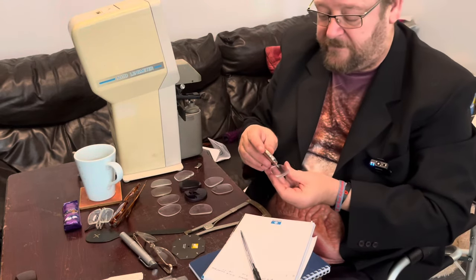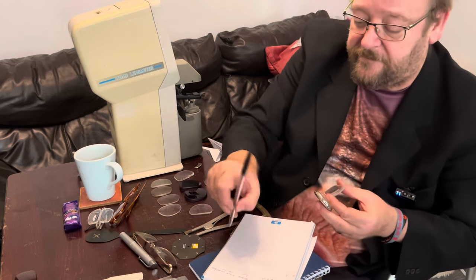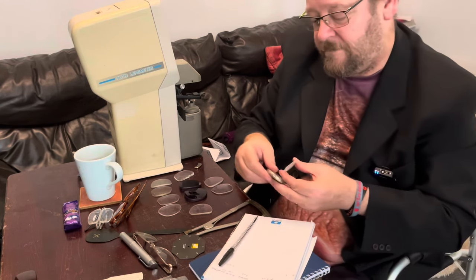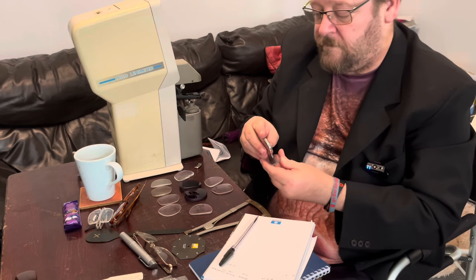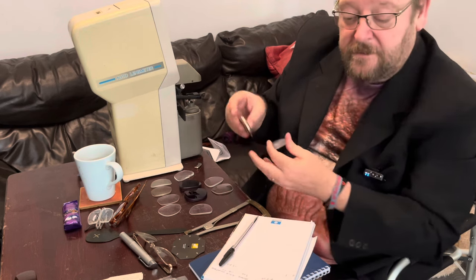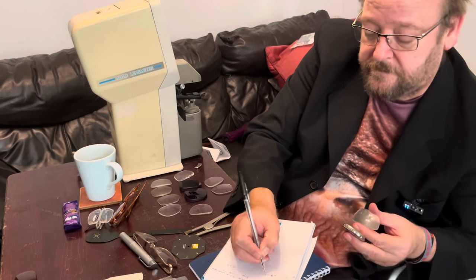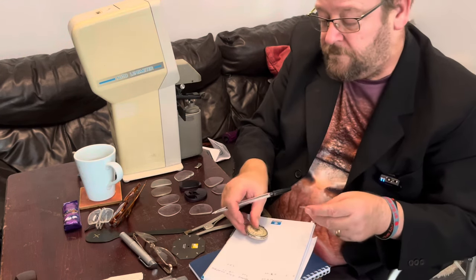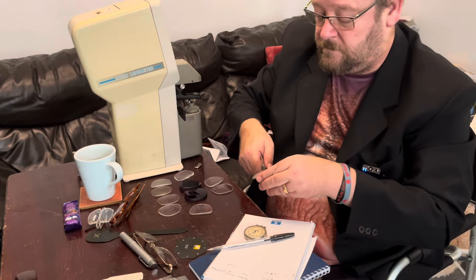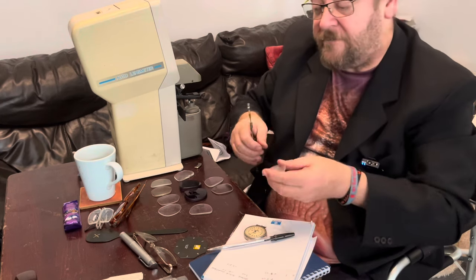Now we measure the back surface again. That one is minus 3.75. And it measures as plus seven on the front surface. And now for the lens thickness — center thickness. That one is five millimeters thick.